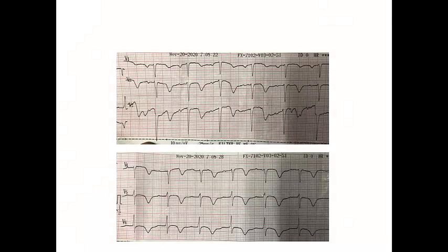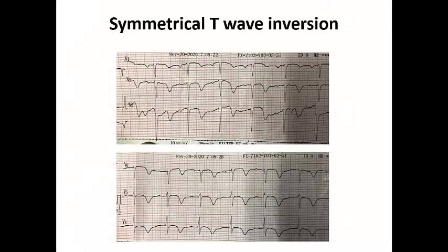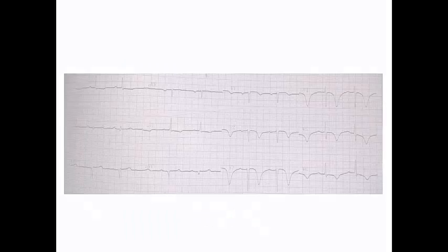In this ECG example, we have evidence of symmetrical T-wave inversion in the precordial leads. They appear to be less than 5 mm, so they are not considered deep, but they are clinically significant symmetrical T-wave inversions suggestive of myocardial ischemia — especially because they are symmetrical.